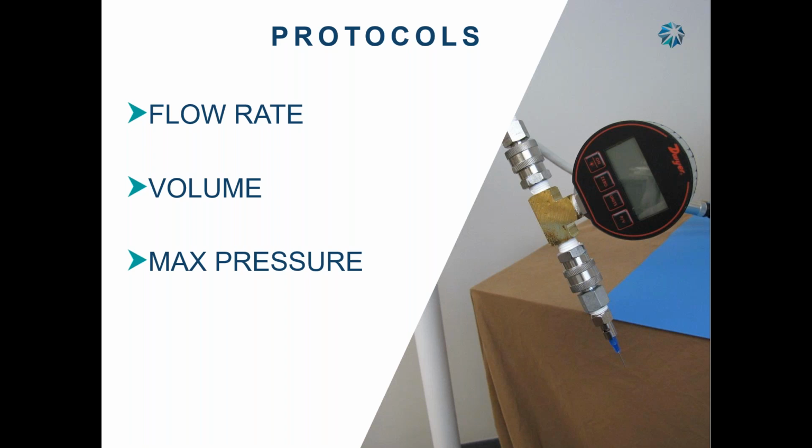So you have your flow rate, how fast you want the contrast to go into the body. Why is that going to be important? What does the contrast mix with when it goes into the body?